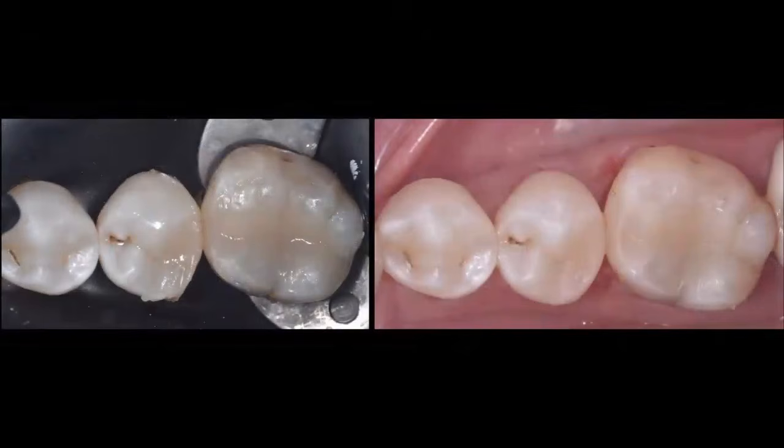So now that both restorations are completed, you can see how nice and wide from buccal to lingual and from gingival to occlusal, how nice and wide and anatomical I was able to recreate that interproximal contact, even though there were two very deep interproximal boxes.